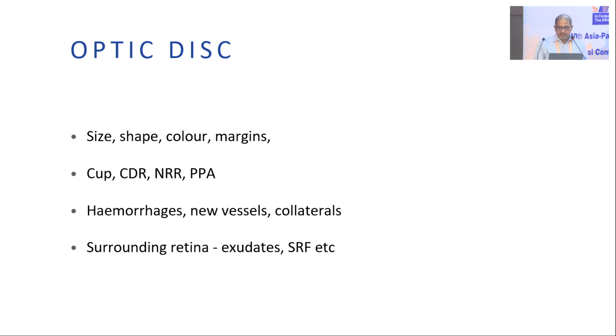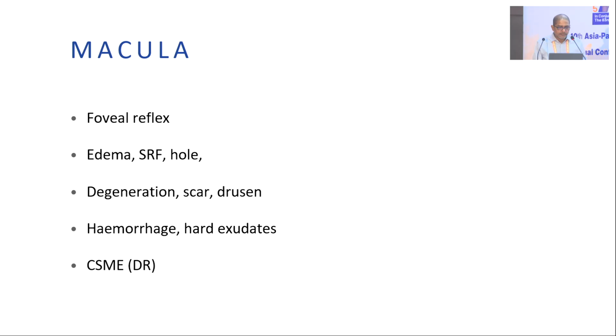And when you have a look at the macula, and other findings like drusen, exudates, fluid, whatever is there, you just try to identify and describe it in a sequential manner, so that the person who is hearing it, even if his eyes are closed, should be able to imagine the fundus which you are describing. And foveal reflex, don't say dull.